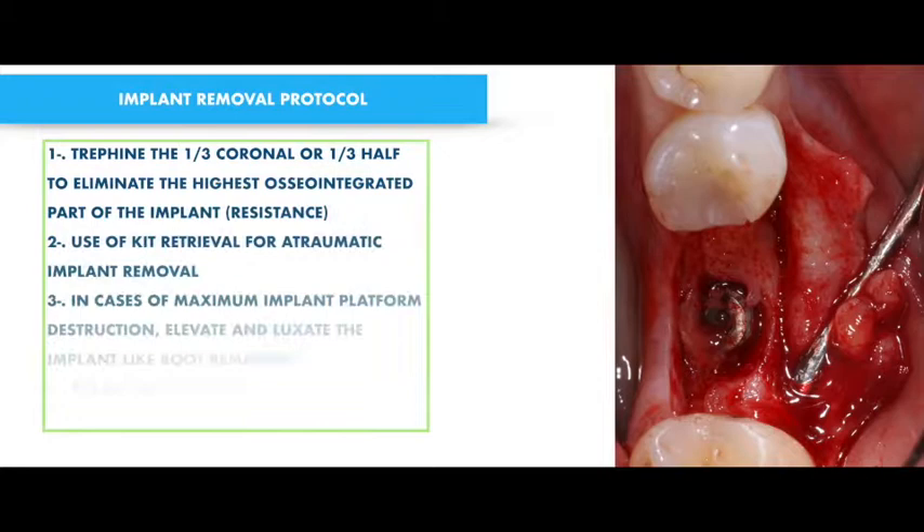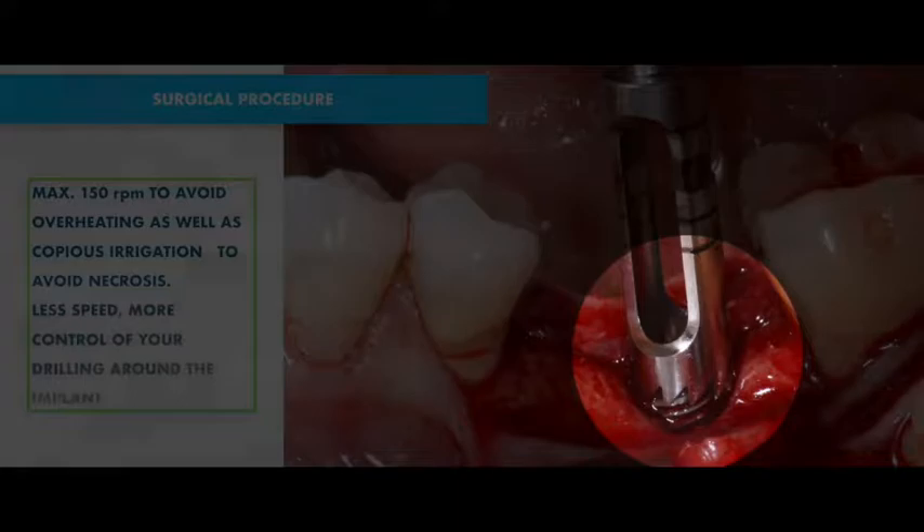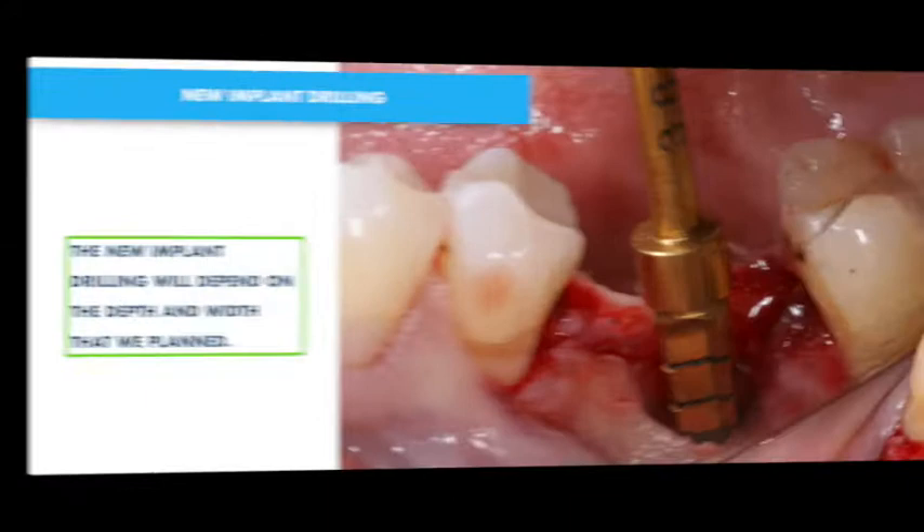In order to be able to see the implant, I want to show this is the implant that I will remove — or rather the rest of the implant that we remove. We are then going to use a 5mm implant in this case.